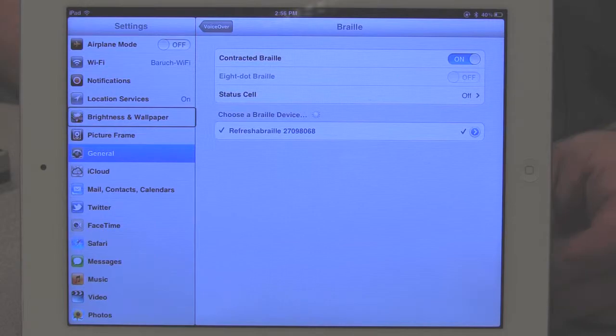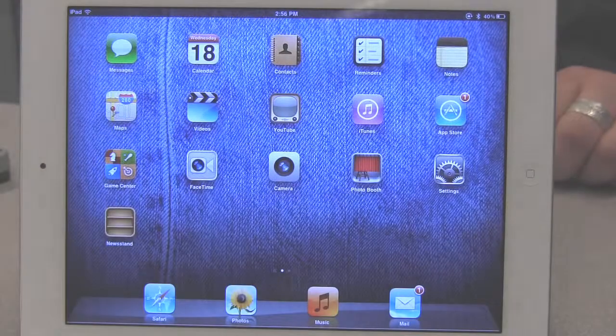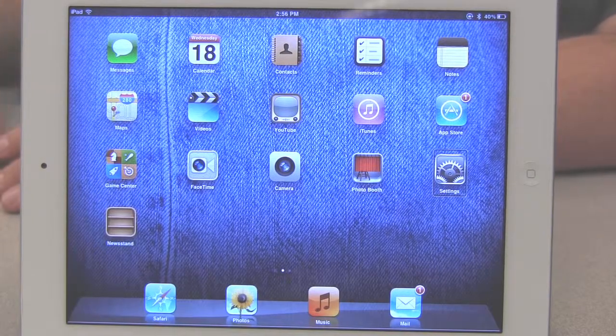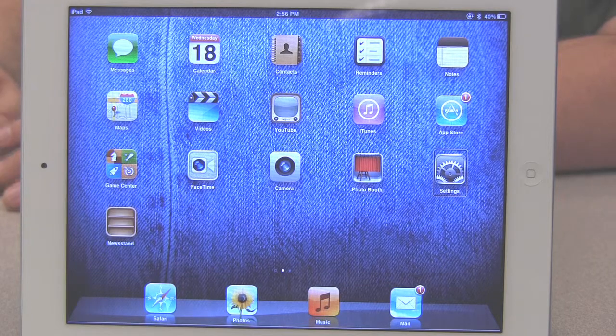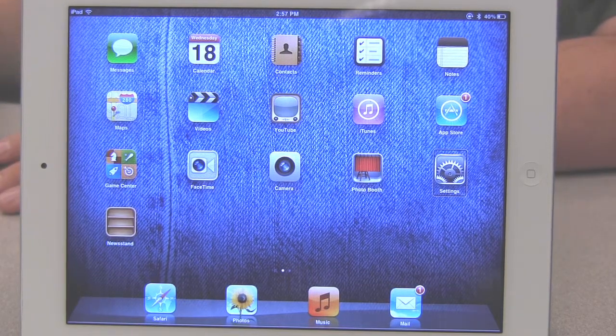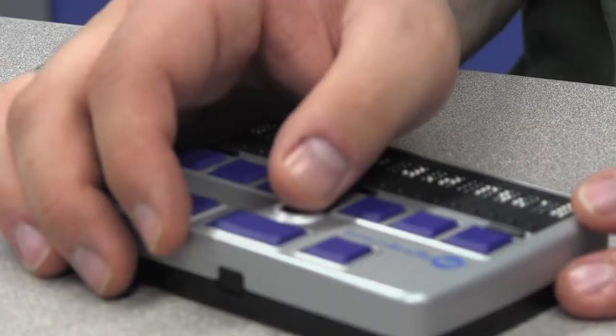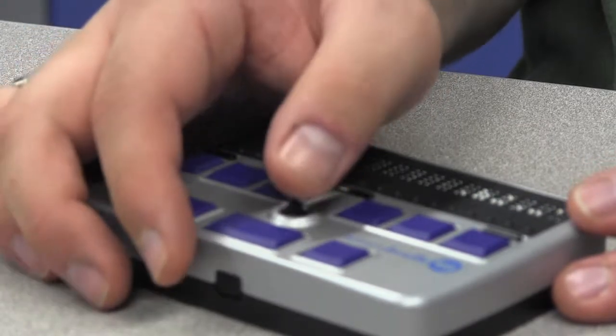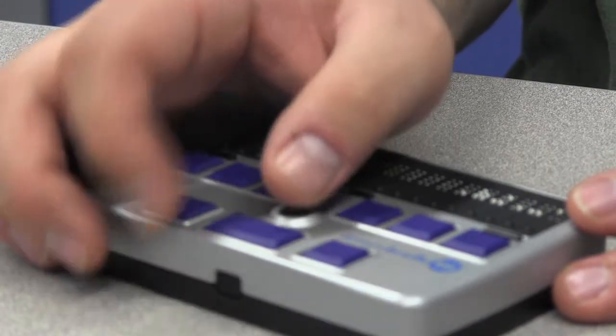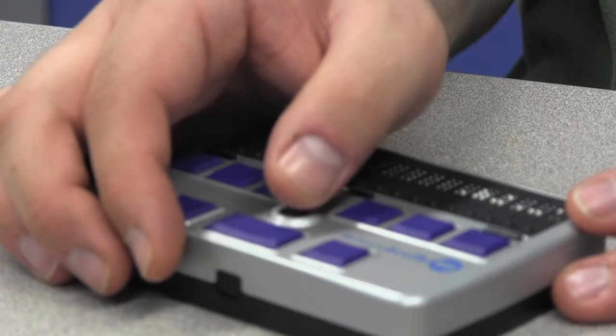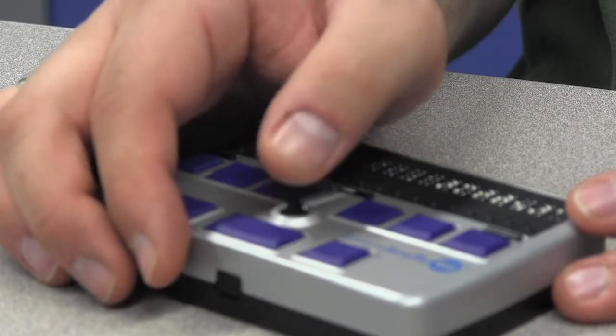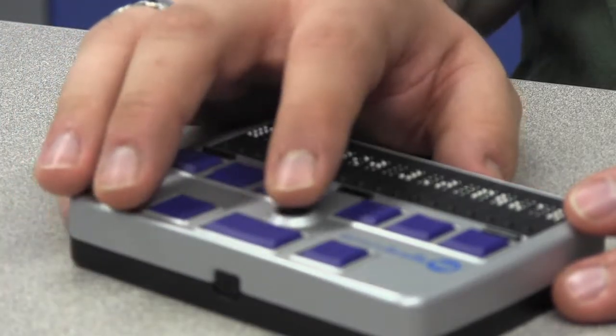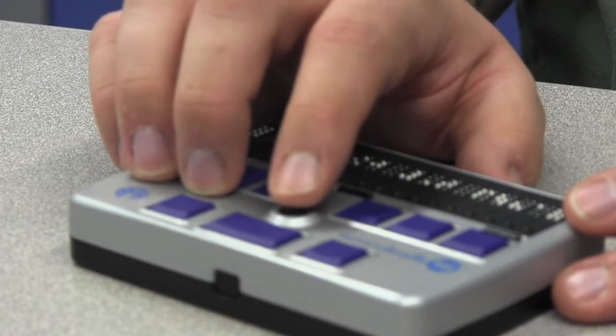I'm going to go back to our home screen. Home, settings, double tap to open. And now using the Braille device, I'm able to navigate through the different icons on my screen. So for example, if I wanted to go back to settings and activate that, I can just use my little joystick here and go to the right. Photo booth, settings, double tap to open. And then press down.